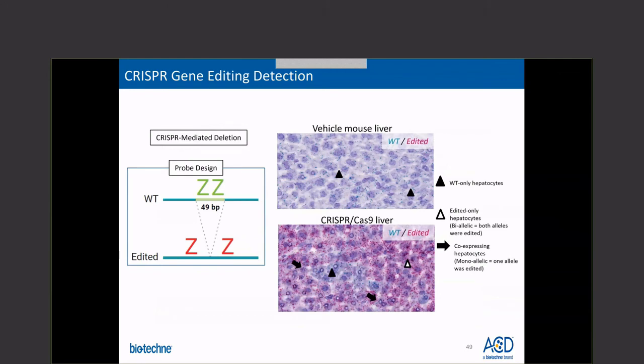BaseScope duplex assay has been used to detect CRISPR-mediated nucleotide deletion. CRISPR-Cas9 was used to delete 49 nucleotides from a gene, resulting in a novel junction sequence labeled edited. BaseScope 1ZZ probes were designed to target either the 49 nucleotides in the wild-type sequence or the edited novel junction sequence. Using the BaseScope duplex assay, the wild-type and edited transcripts can be visualized simultaneously. The image on the right shows staining of wild-type, biallelic or monoallelic hepatocytes.